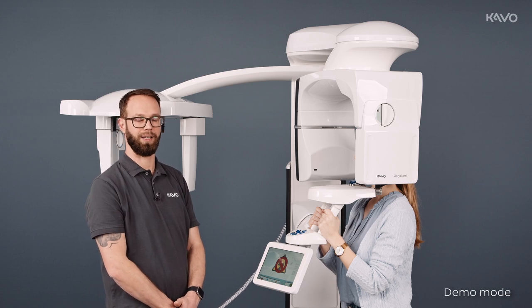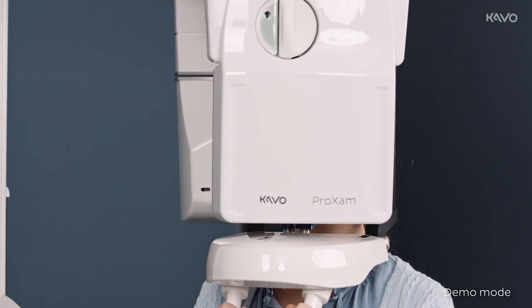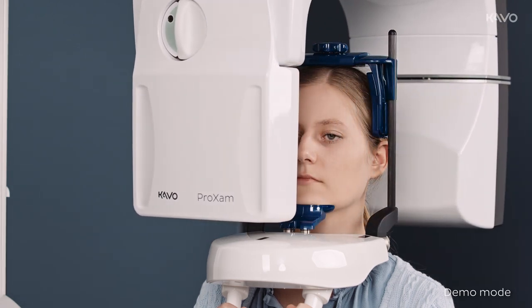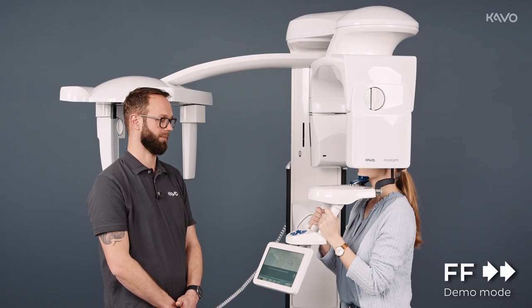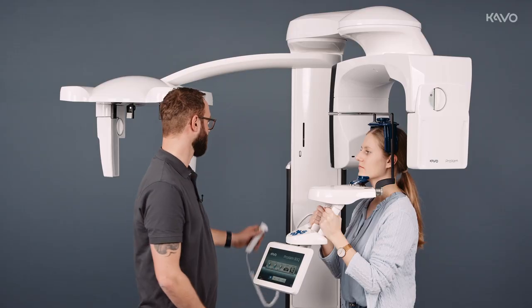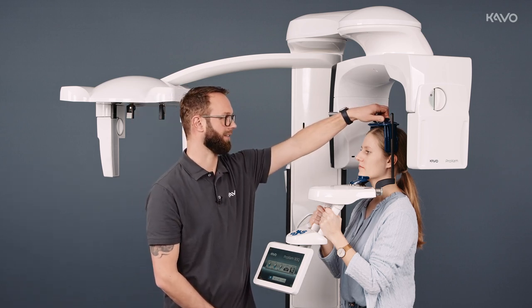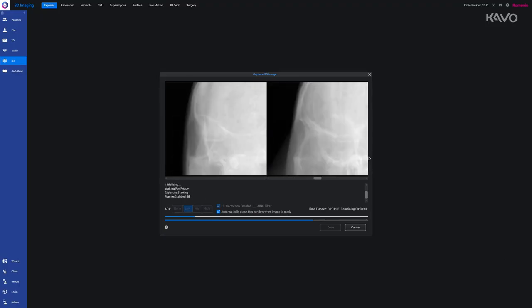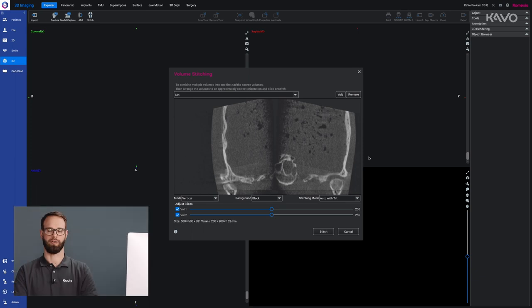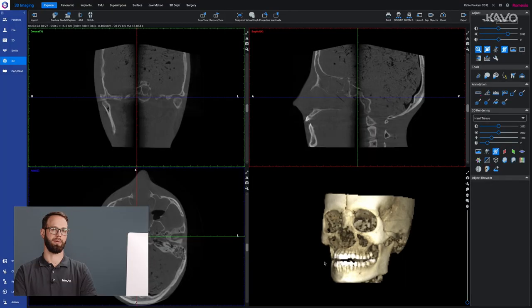During this time, we keep our finger on the trigger button. The imaging is now complete, so we can let the patient exit the unit. We do everything else in Romexis. After the image has been taken, we move on to stitching in Romexis to merge both volumes. The imaging is then saved in Romexis.